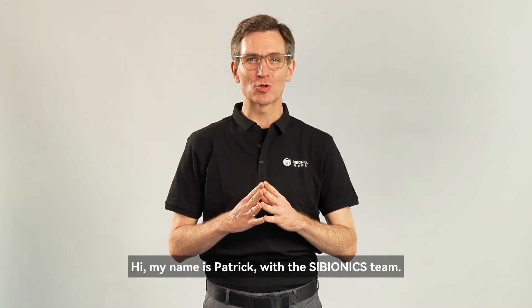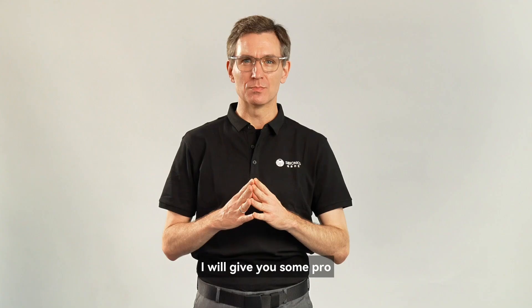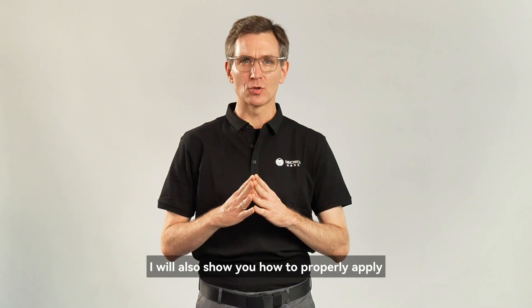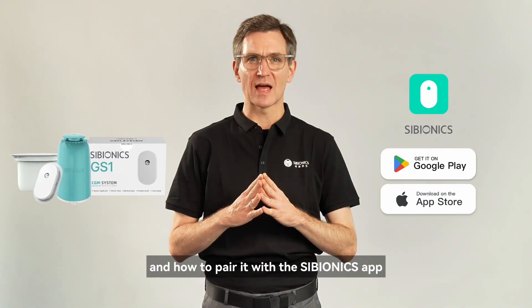Hi, my name is Patrick with the SIBIONICS team. In this video, I will give you some pro tips on how to get started with your SIBIONICS CGM system. I will also show you how to properly apply the SIBIONICS sensor, how to make sure it stays on, and how to pair it with the SIBIONICS app.